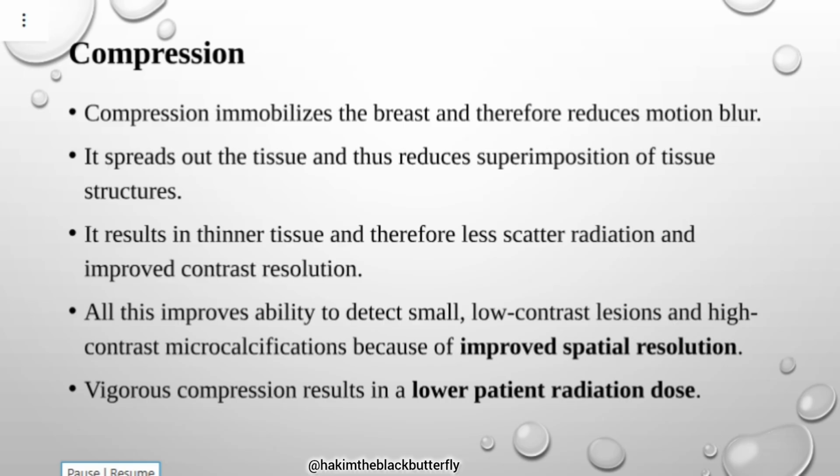On special occasions, it is performed when the patient is sitting, for example, a patient who cannot walk. There is always a chair in mammo rooms where the patient can sit, and it can be adjustable. It is adjustable, and then the patient moves up to the level where the breast can be positioned.